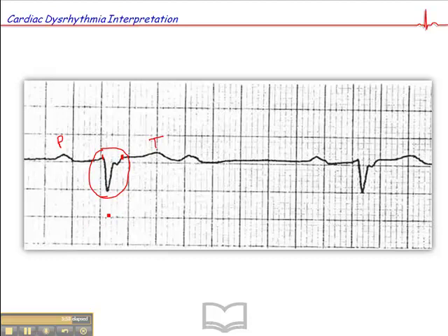And if you look at this in a different lead, what you probably see is something like this. A QRS that comes down like that, and comes down like that, and back up again. What we see here is just kind of a little glitch, but in fact that's the entire QRS. This is a P wave here, P wave here, QRS complex here, sorry I meant to include that glitch there, and a T wave here. So that's a second degree AV block, type 2 with a heart rate of about 33.